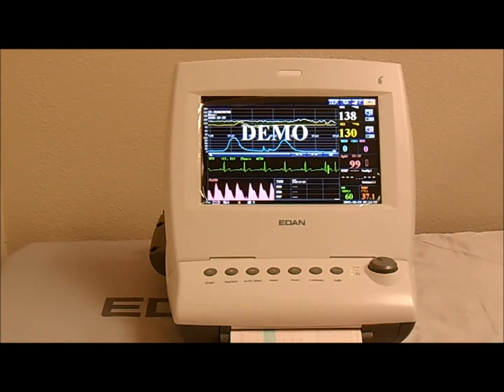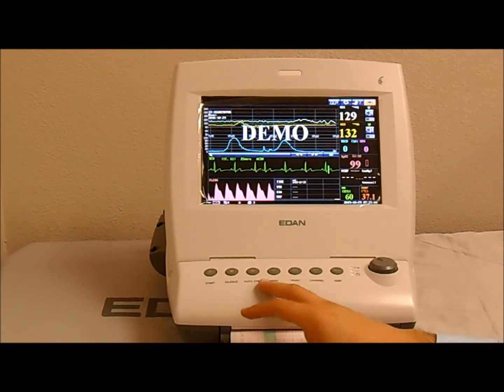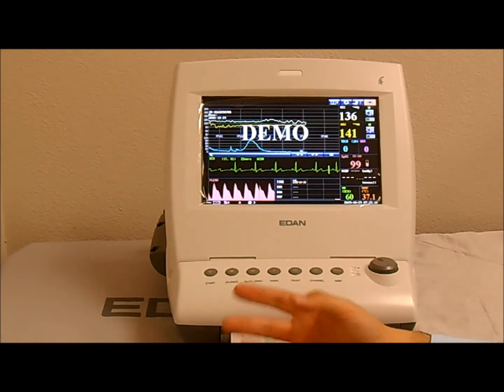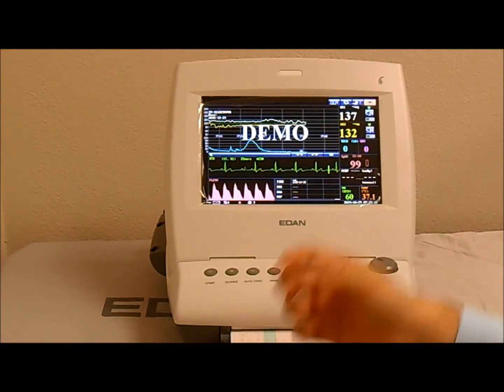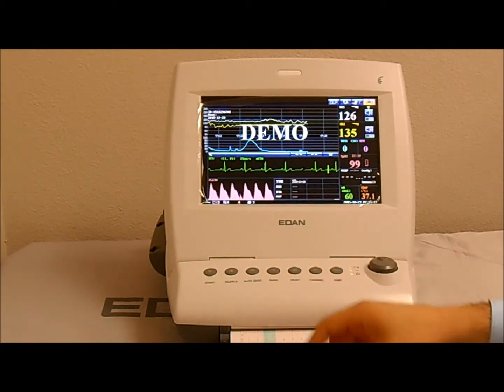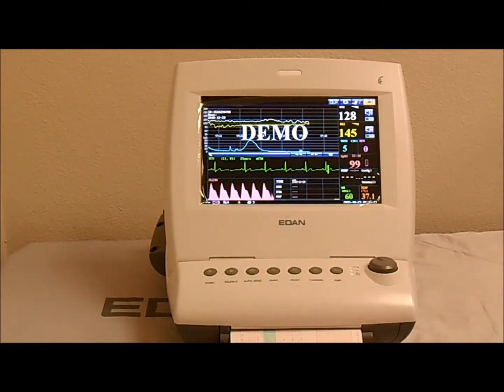So when will you have to use the auto zero? Take, for example, you have a current patient. After 5 minutes, the patient moves or the belt becomes loose, and you have to reset the transducer. You place the transducer on the patient. Again, there's going to be some initial excess force. You press the auto zero, and it'll take you back to baseline.